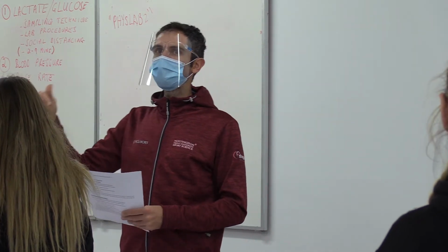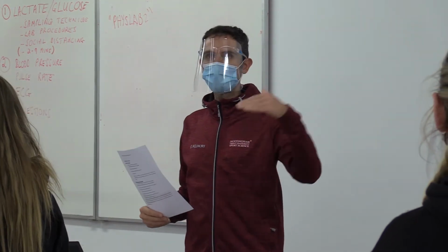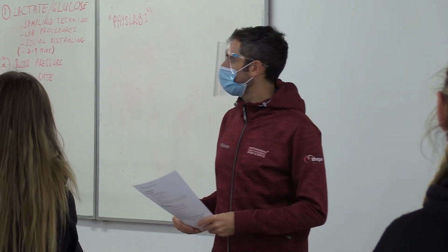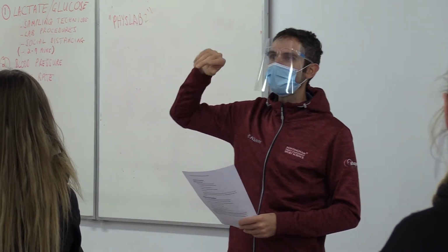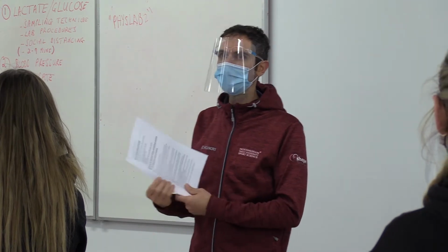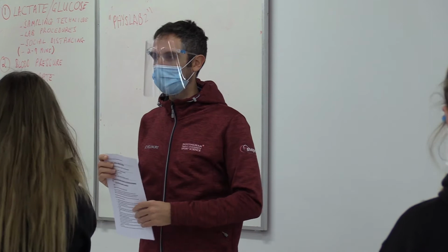The person that uses the least amount of oxygen for a certain intensity of exercise is likely to have a greater aerobic fitness capacity. In the second term, we will look at VO2 max, where we'll actually exercise to our maximal performance, and so see the maximum amount of oxygen we can utilise in a minute. But today, as mentioned, we are just going to look at VO2 and VCO2 from a sub-maximal exercise test using these bikes that are dotted around the lab.